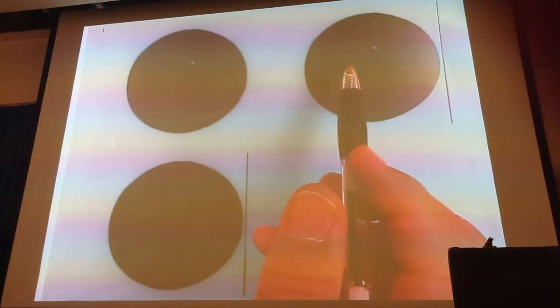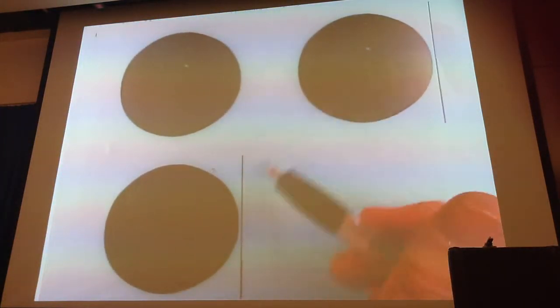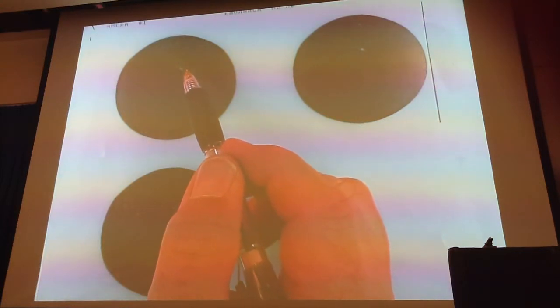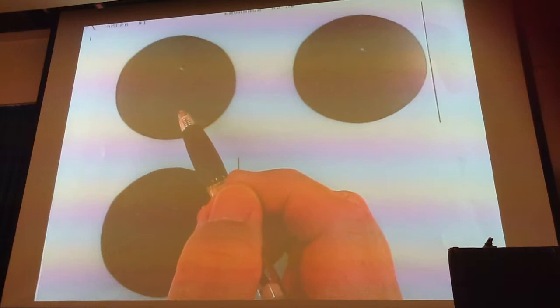Yeah. I mean, I don't know why they did three of the same picture here, but normally, whenever I see something like this, I try to rotate the collimator, and if this thing moves when I rotate the collimator, then it's definitely in the collimator. Okay? If it stays in the same spot, that means that there's something wrong with the crystal, probably. Okay? Or with the computer.